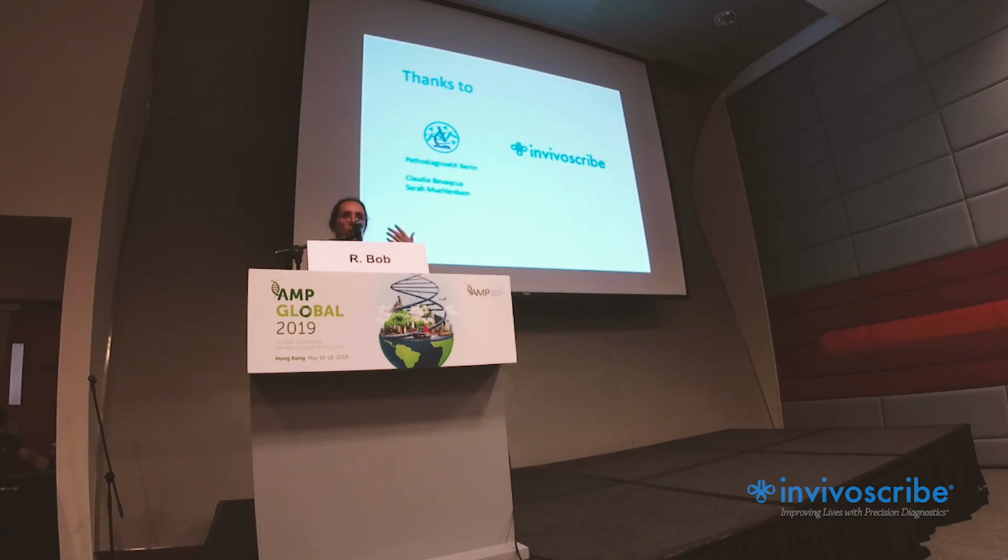So if you don't have too much somatic hypermutation, then it correlates quite well. That's the reason that when it's possible, you do the microdissection. But in many cases, like marginal zone lymphomas, you always have the lymphoma cells mixed in the reactive background. You cannot do it.